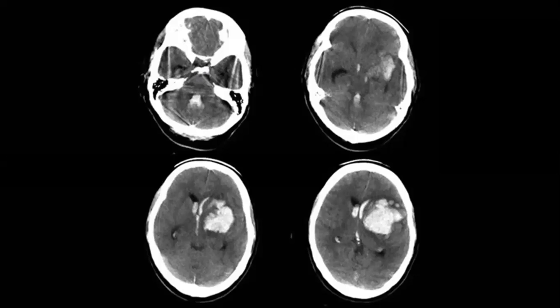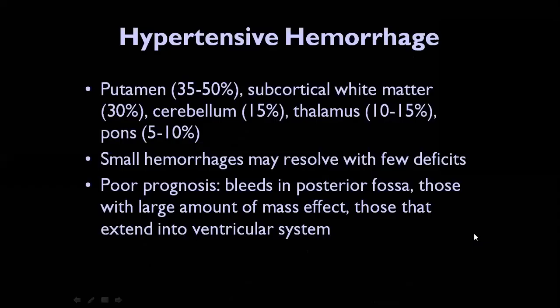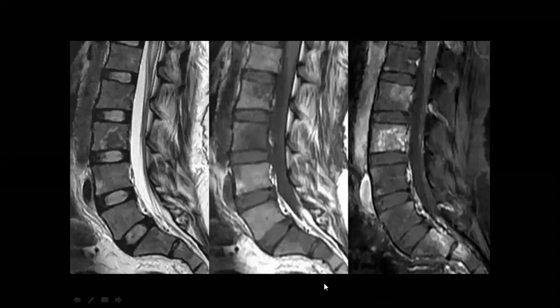As you know, in the textbooks you will find this table is very common in the exam. They mention the place, and you say which common aneurysm should be situated here. I think we have this in this review. So yeah, it's more going with something larger. It can be a hemorrhagic tumor, it can be a BAVM. Yeah, I agree.